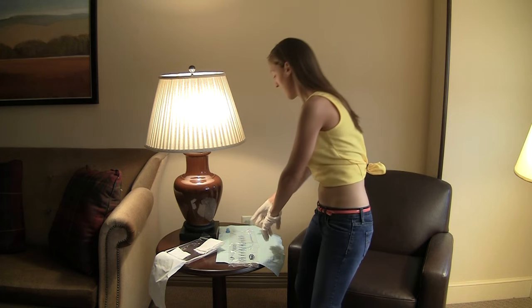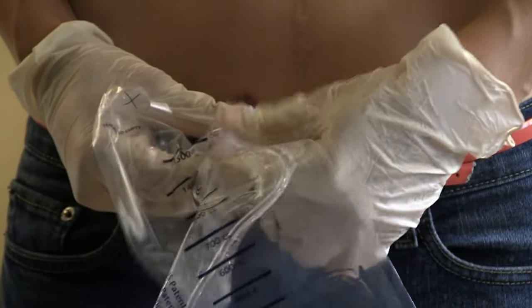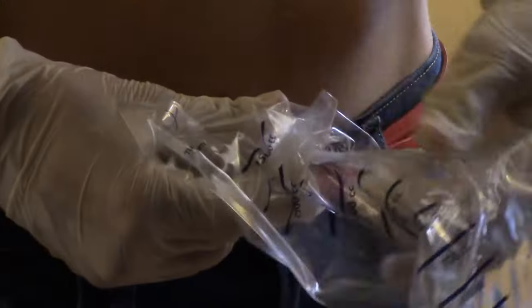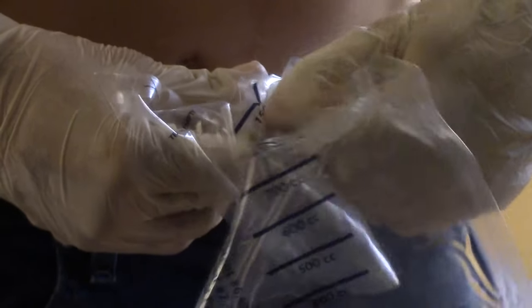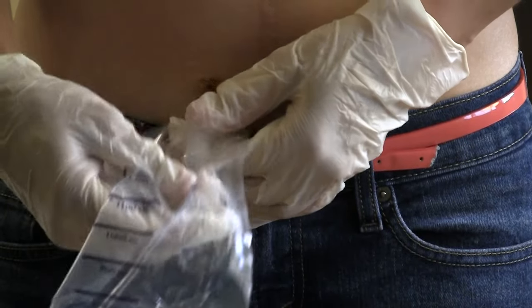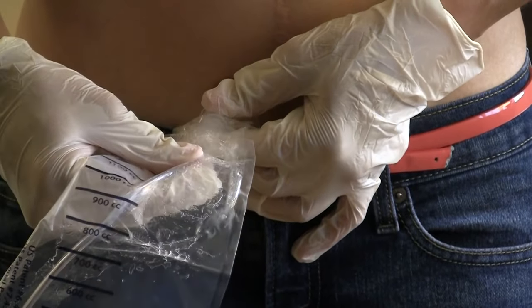Now I'm going to start catheterizing. As I said before I'm going to take the tip and put it towards my stoma, and now I'm just going to feed it in until I get some urine. Once it hits, I'm going to push a little bit further so that it's at the center of the bladder.